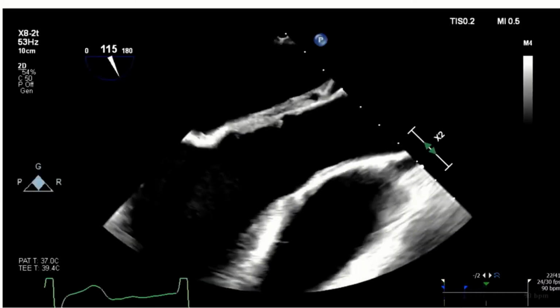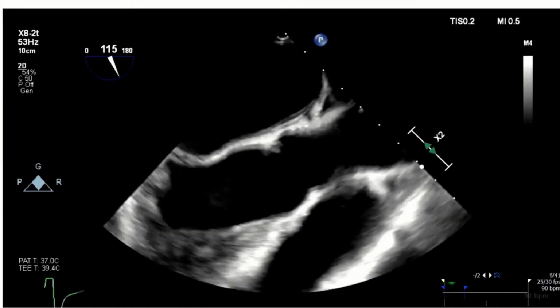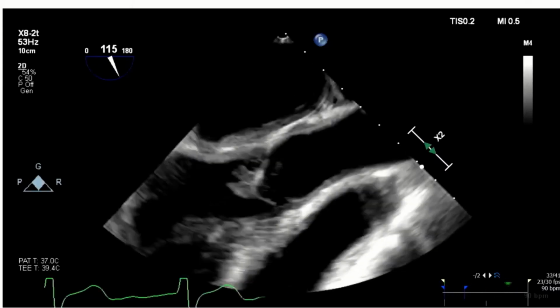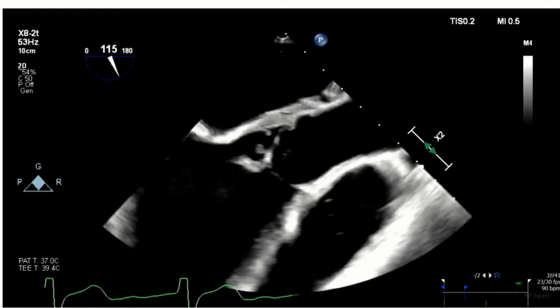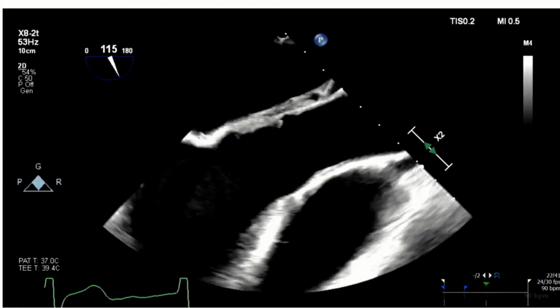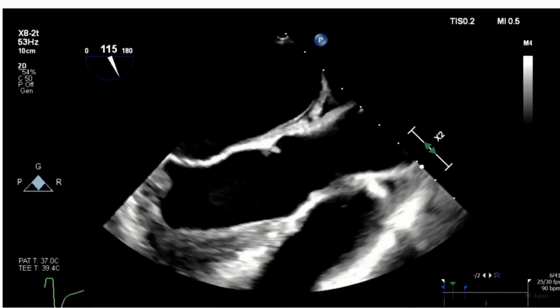So here is another picture, and this whole talk today is going to be a lot of show and tell. We talked to you about what you can find. I really would like to show it to you. So this is what is hanging in there on that aortic valve. That's a vegetation. You've seen how it looked when Dr. Wynn showed it to you on the pathology report. This is how it looks in real life. Those little things shouldn't be there.